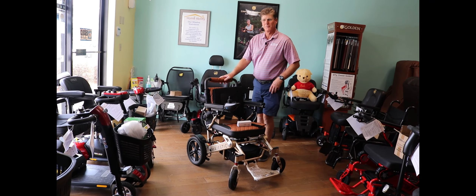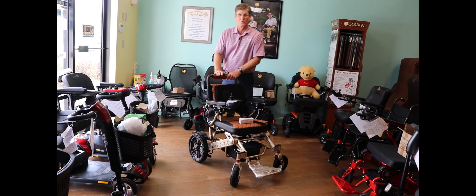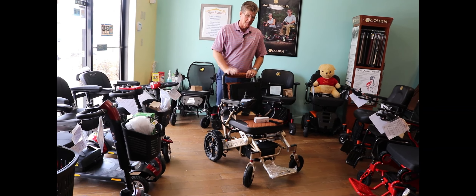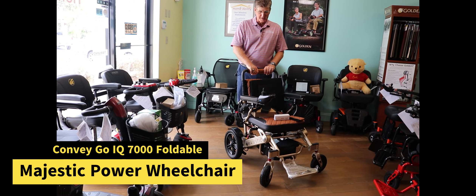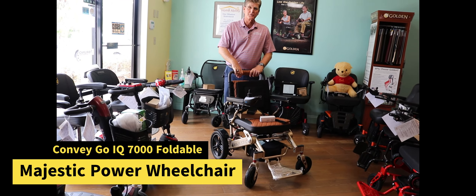This is Steve again at the Home Ability Store. As promised, we've unboxed the brand new ComfyGo IQ 7000 Foldable Power Wheelchair.